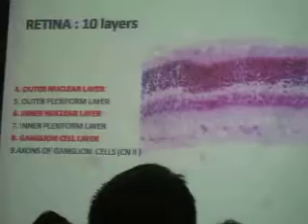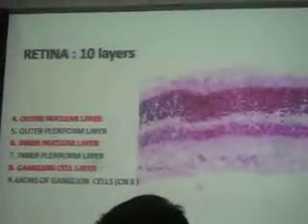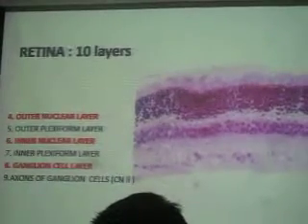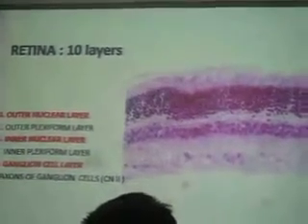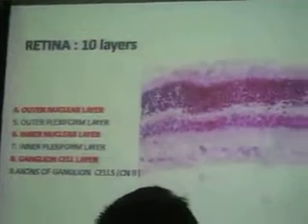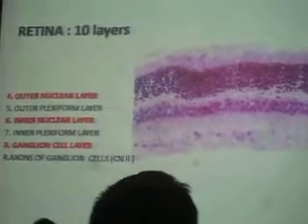So if you're asked what the optic nerve represents, the answer is axons of ganglion cells of the retina. Okay, so the cranial nerve 2, or your optic nerve, are the axons of the layer that you have in the retina, specifically ganglion cells. Okay?